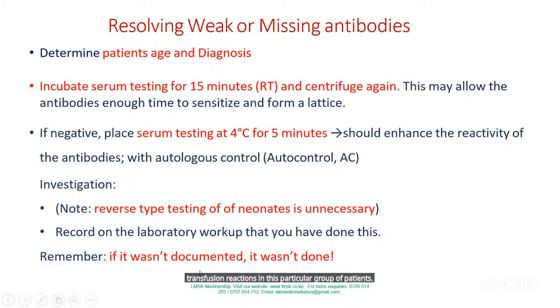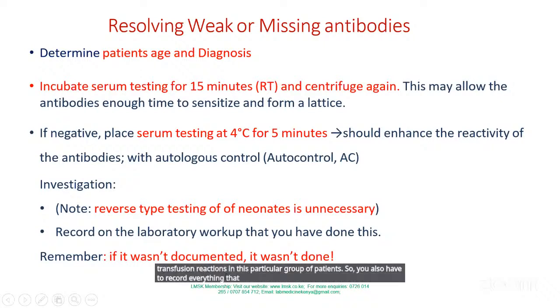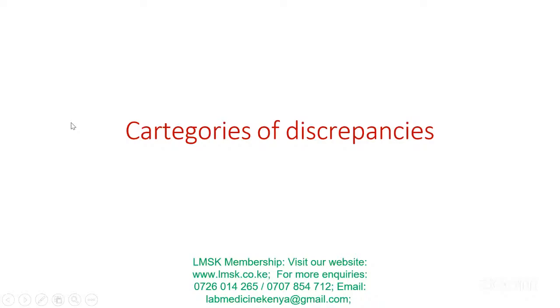You also have to record everything that you've done. Documentation is very key, and as quality dictates, if it is not documented, it is not done. Up to that point, we want to look at the categories of discrepancies.